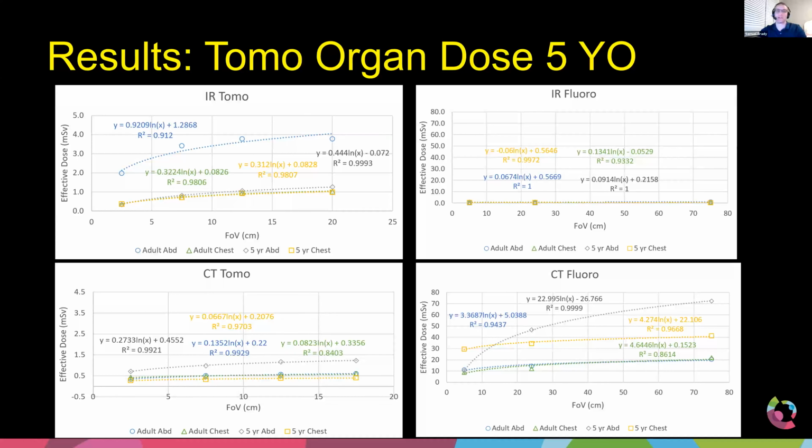In other words, if you're still upstairs or wherever you're at in the interventional suite and you do a normal cone beam CT, obviously the image quality is going to be slightly different. We talked about that last week. But dose-wise, they're pretty equivalent. There are some cases where they may be a little higher, but they're mostly equivalent.